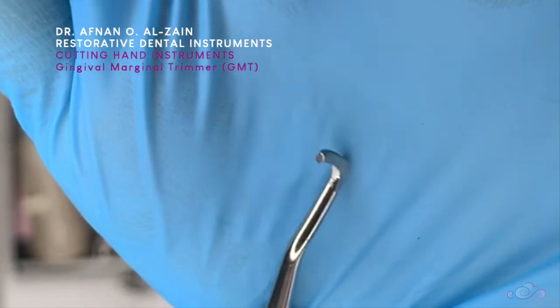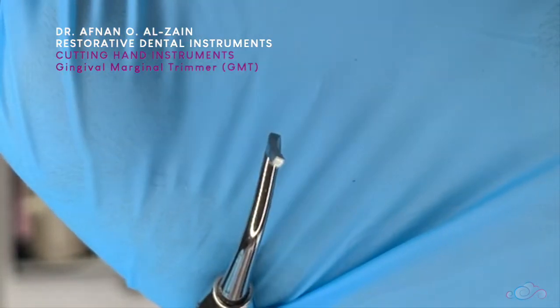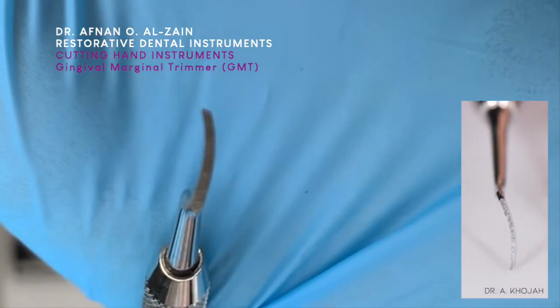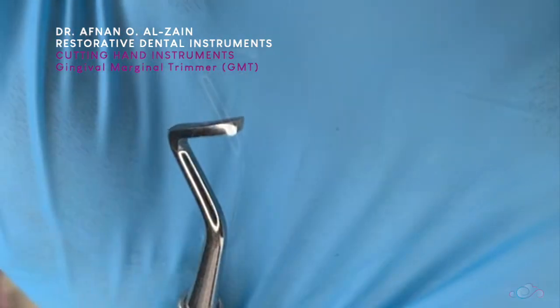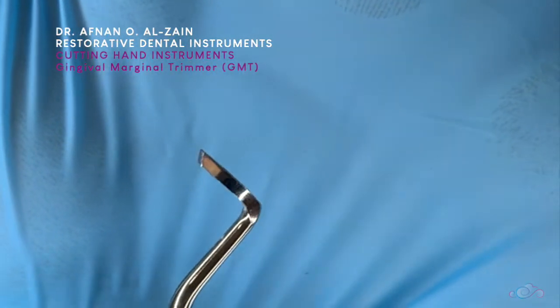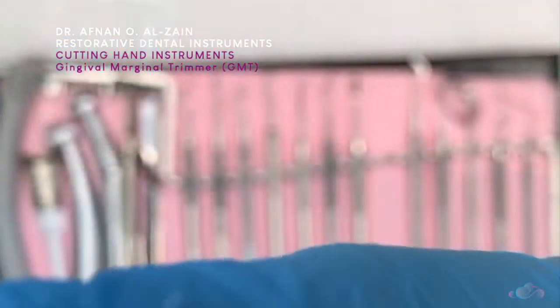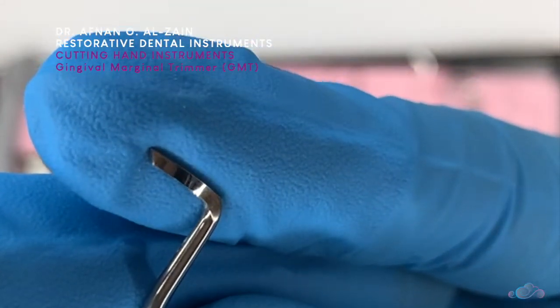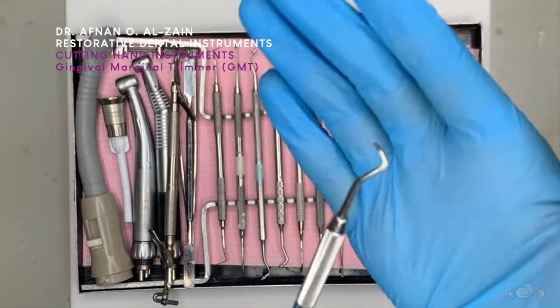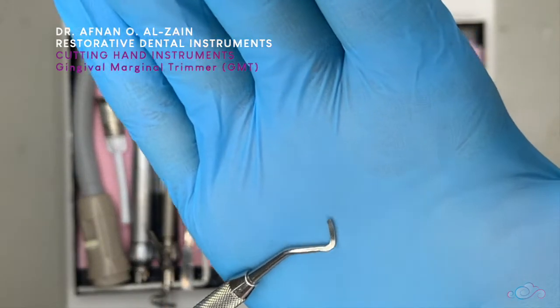Here we have the gingival marginal trimmer, or GMT. We can see how it is curved, unlike the enamel hatchet. It is also double-ended, and there is also an angle — we're going to talk about that in detail in a separate video.